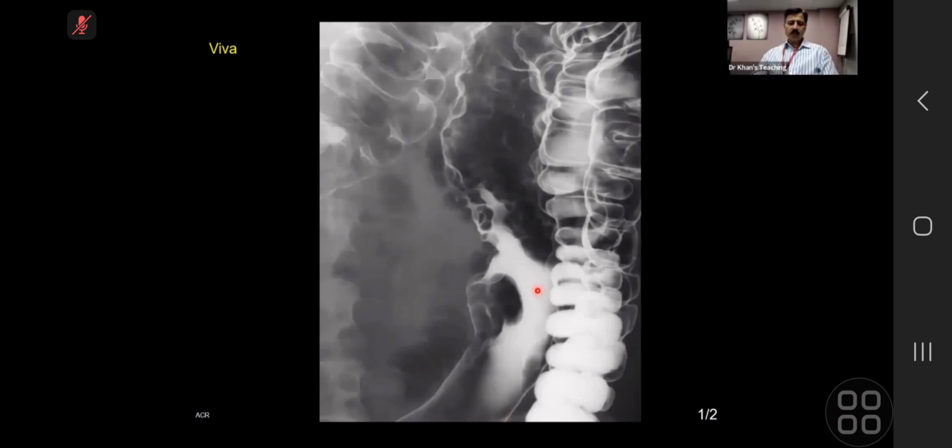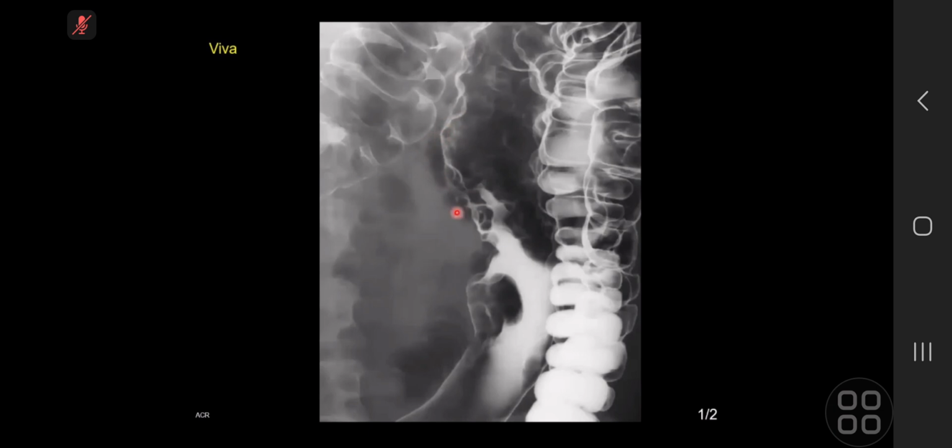Hint, it's an Aunt Minnie case. Look at the profile here. Look at the wall. This is a hint. There's edema as well. Is this a cobblestone kind of appearance? Right. Okay, I'll take over.